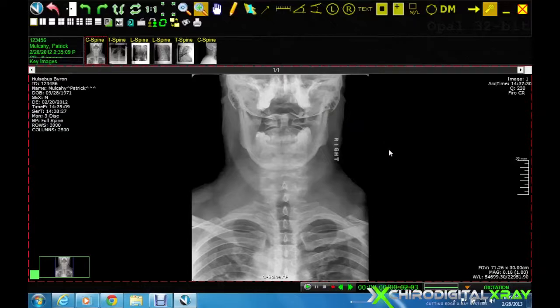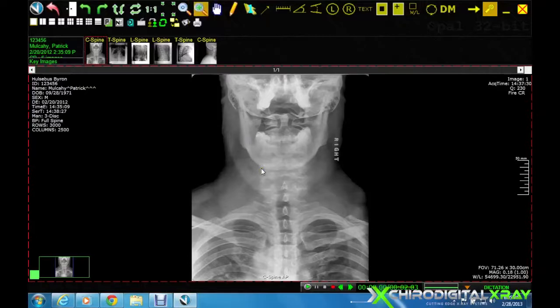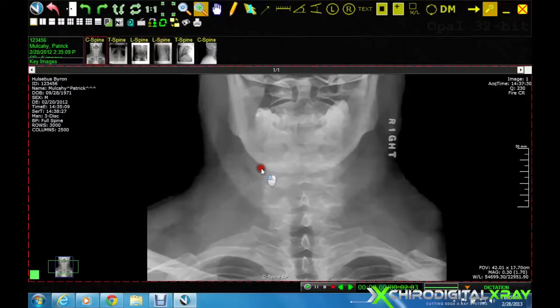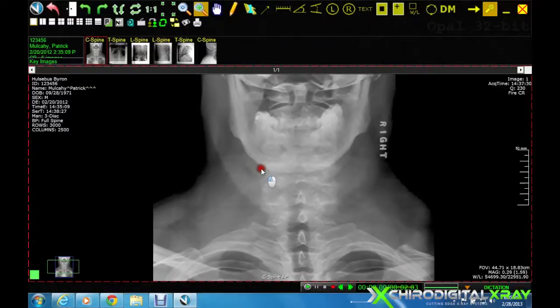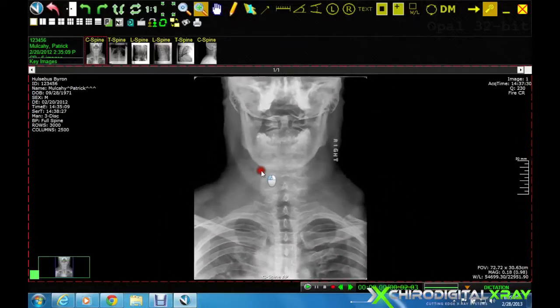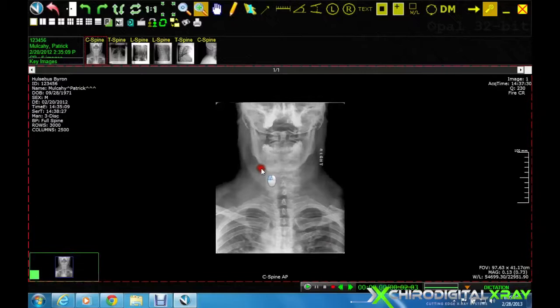The zoom tool allows us to increase or decrease the overall size of the image. By left clicking and holding down the left mouse button and rolling the mouse forward, we can increase the size of the image. By holding the left mouse button down and pulling the mouse backward towards us, we can decrease the size of the image.